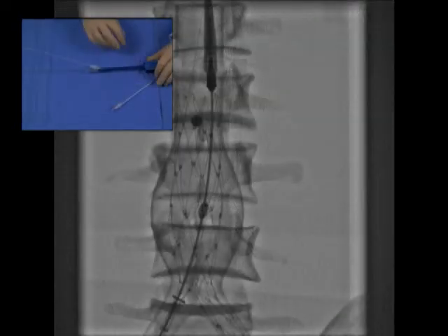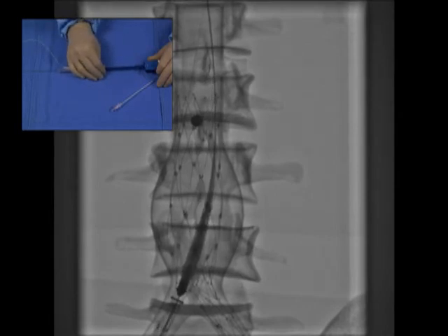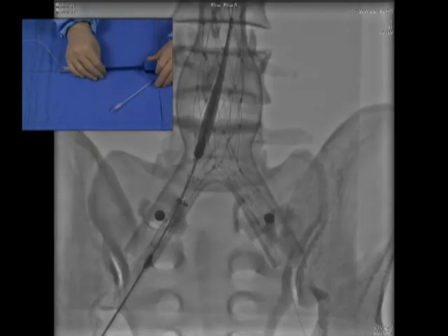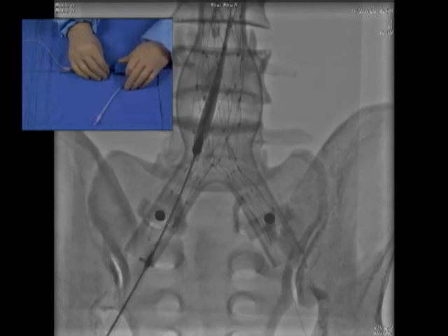To deploy the ipsilateral limb, first, stabilize the retraction hub and pull the inner core assembly until the radiopaque tip is just above the bifurcation. Then, hold the inner core assembly stationary and pull the retraction hub until the ipsilateral limb is completely deployed.